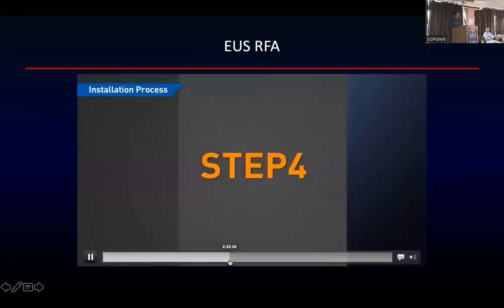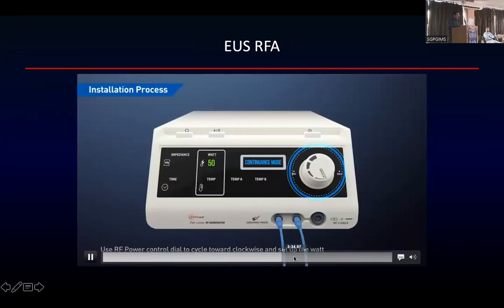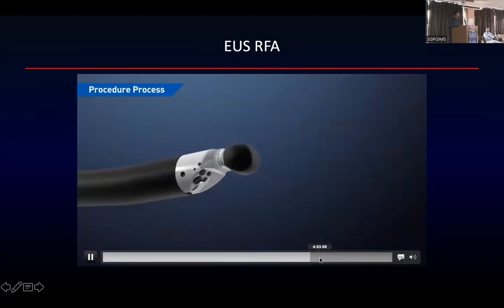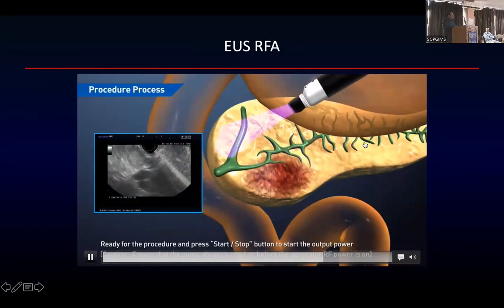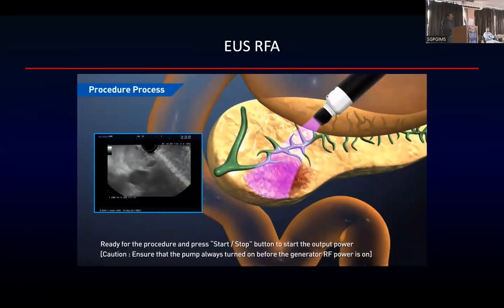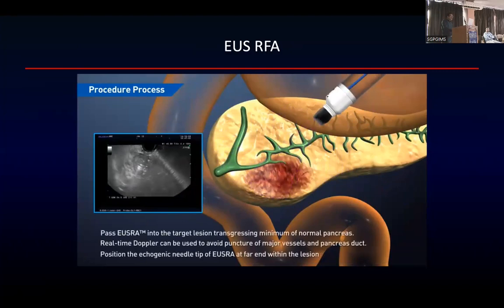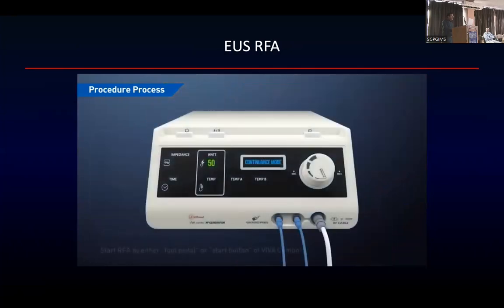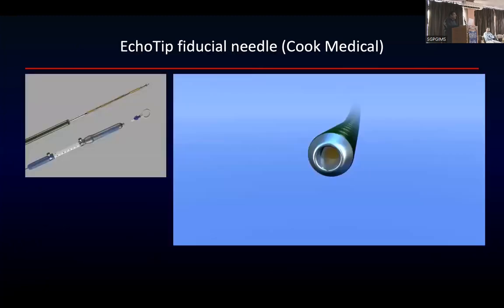So this is how it looks. And if I just show you how it is being used, these are again how the connections are made. You may not need to know this. And then ultimately you use this. So it's very simple, like doing an FNA. You puncture with this, then you activate the RFA processor, and you bring about the coagulation of the tissue that you intend to achieve. Again, you have to be cautious that you don't destroy the normal parenchyma, otherwise the patient will have pancreatitis post-procedure.